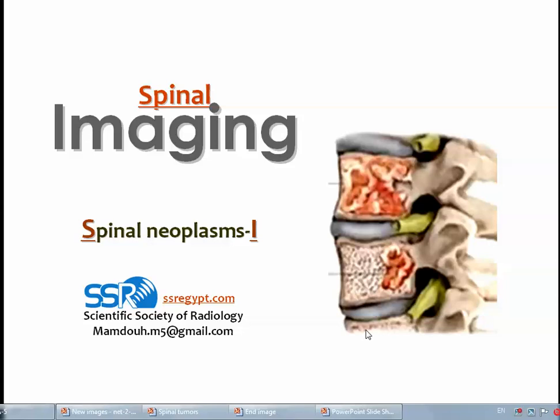Dear colleagues, this is the last lecture in the sector of spinal imaging, and it will deal with imaging of the spinal neoplasms. Actually, I will handle this topic in two separate parts because it is relatively long.